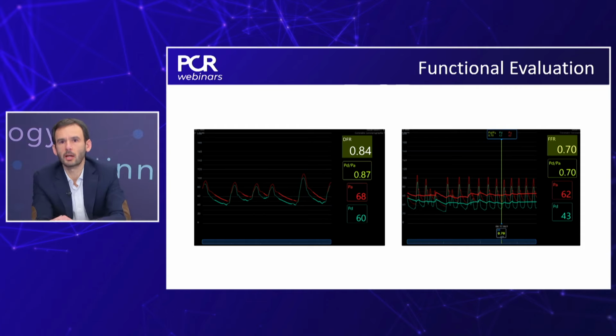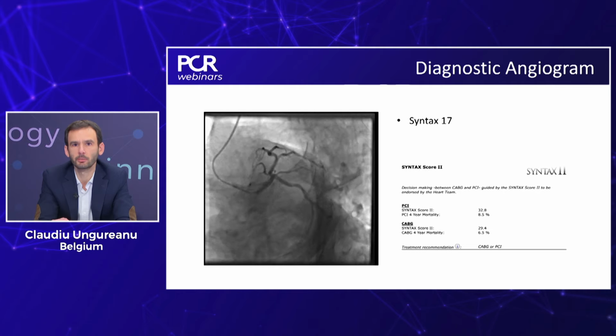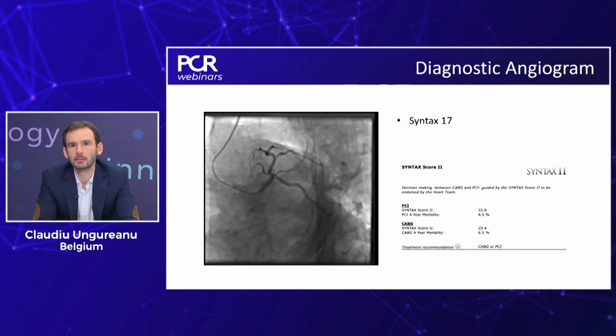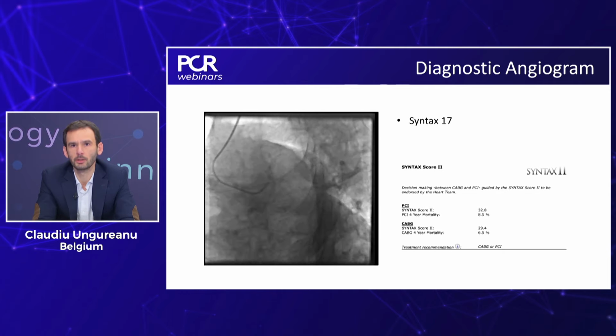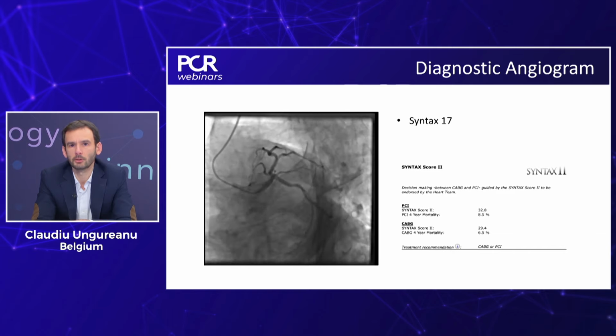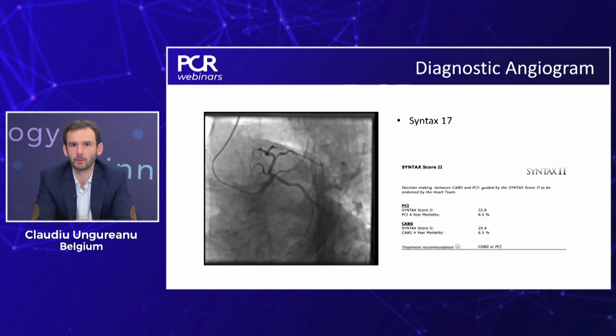To add something to the discussion, we calculated the SYNTAX 1 and 2 scores for that. You can see also another projection, a spider projection, in the image. For sure, we have a SYNTAX 1 of 17 taking into account the calcified lesion and without taking into account the left main or other bifurcation. Proximal and mid LAD, and with the SYNTAX 2 that is similar for PCI and for CABG, related also to the 4-year mortality, we have an equipoise between the two approaches. Given that we have a young patient who is symptomatic with proof of ischemia, revascularization is indicated in this particular case, and we propose treatment by PCI.